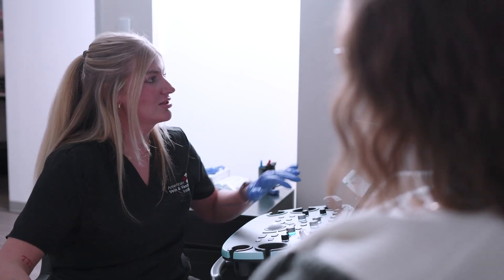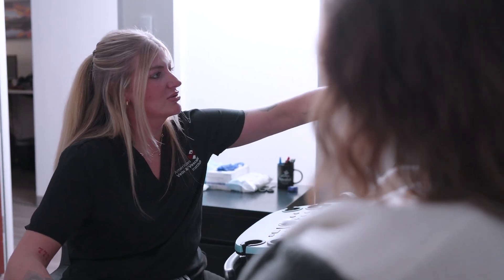At American Vein, this exam is very detailed. It takes about 60 to 90 minutes and we take pride in making sure this exam is done thoroughly and accurately. It's very important to get this information right because a lot of treatment decisions are based on this ultrasound.